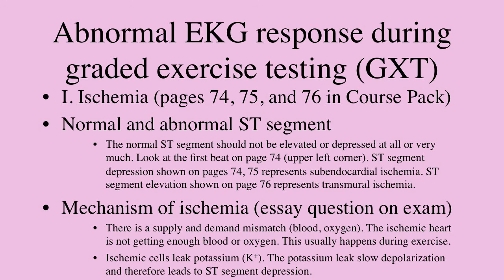The other item here is ST segment elevation, and this is something that we actually touched on earlier in the course also, but you'll see this every once in a while, not that common. Maybe you're testing a lot of patients every day for a month, and you might see it once or something, so it's not very common. But the ST segment elevation, as shown on page 76, is representative of transmural ischemia, where the ischemia goes through the entire myocardium. So it's not just in that subendocardial layer, but it's through the entire myocardium you have ischemia. So a lot of area of ischemia.